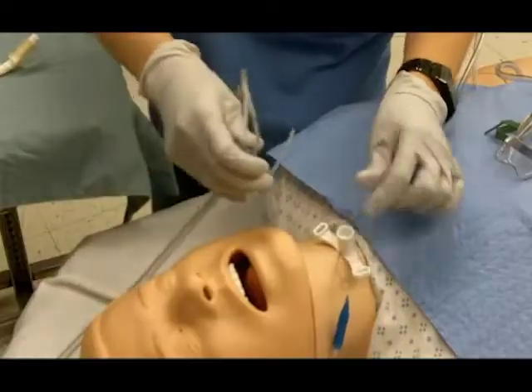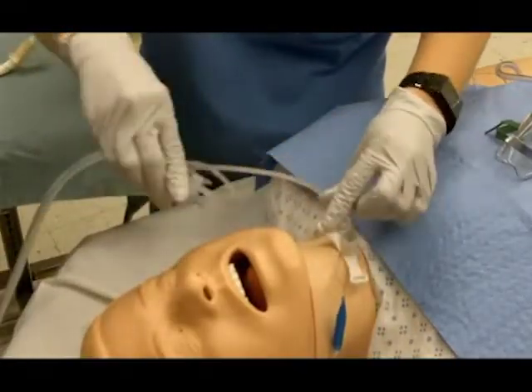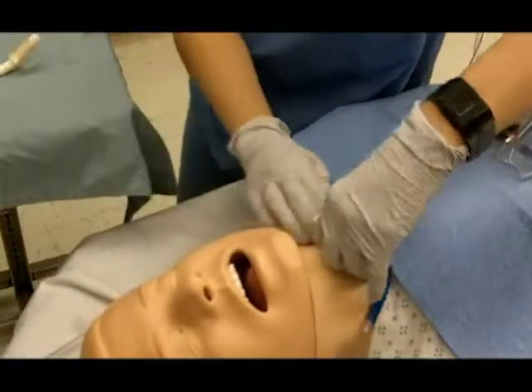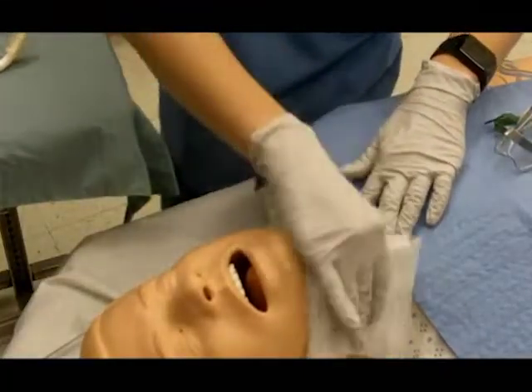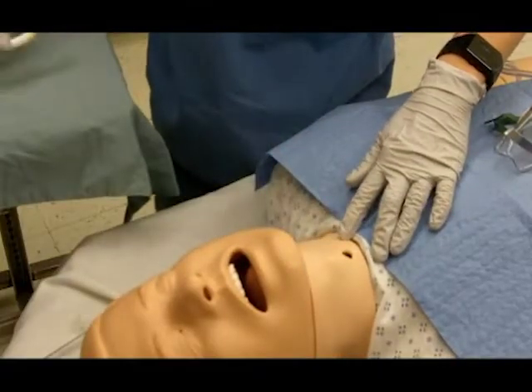Gently remove the old trach tube along its curve in a single sweeping motion. Observe the skin for irritation, breakdown, or signs of infection. Wipe away any debris with a small amount of hydrogen peroxide or saline on gauze.